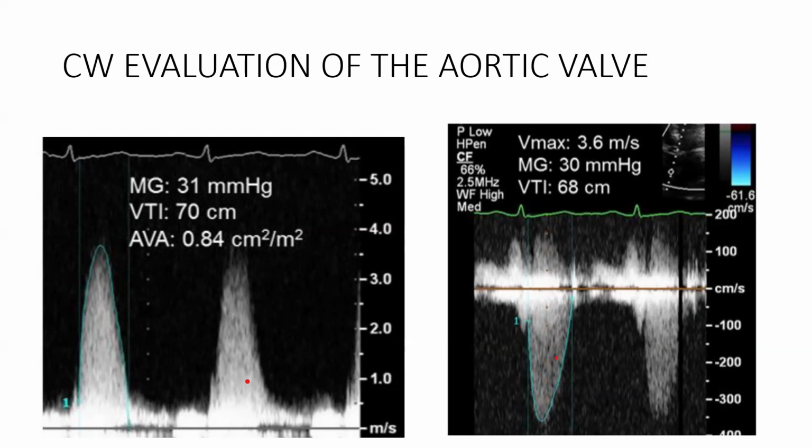So in this patient, you want to be evaluating this patient. Yes, he's symptomatic, but are the symptoms a result of the severe aortic stenosis? Or is it because of a pseudo-severe aortic stenosis? Because that will inform your decision to go for surgery. Yes, like you rightly mentioned, you can do the CT scan, and you can use that to evaluate the severity. But you still want to know, is this gradient significantly above the criteria? So this patient can still have a stress test, but like you rightly say, it's 80 something, so you can do a treadmill stress test, all right?